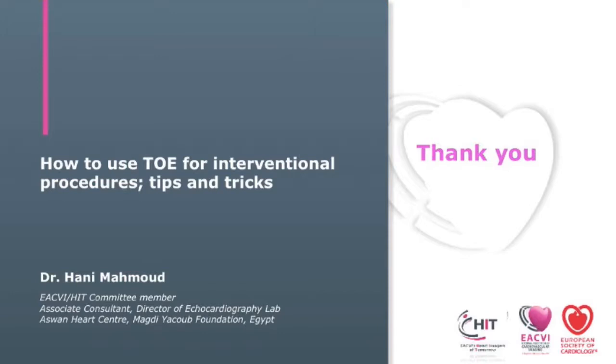Another question is, how many echo procedures do we need to gain competence in TAVR procedures? You've shown exclusively echo, but of course we also use fluoroscopy and CT. We have to make this clear, but you showed nicely how we can also guide by echo.